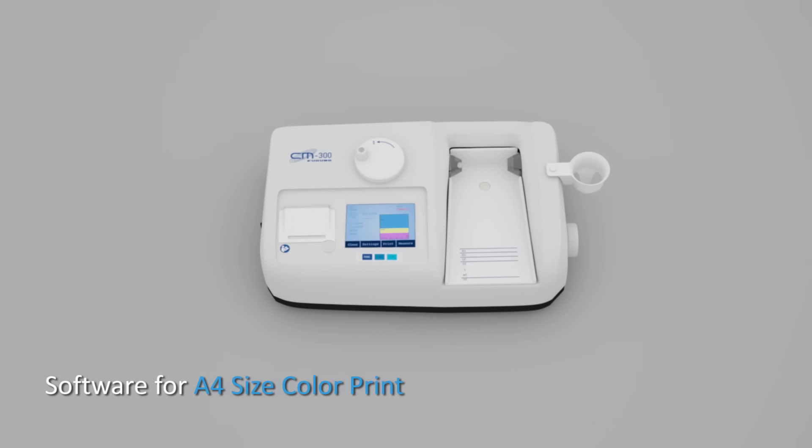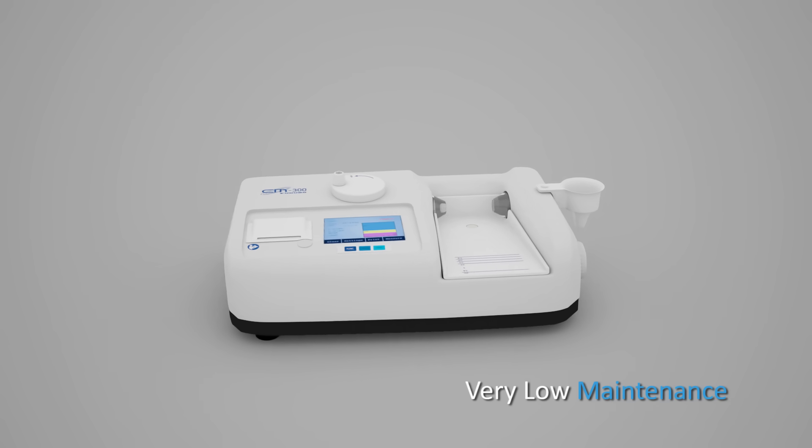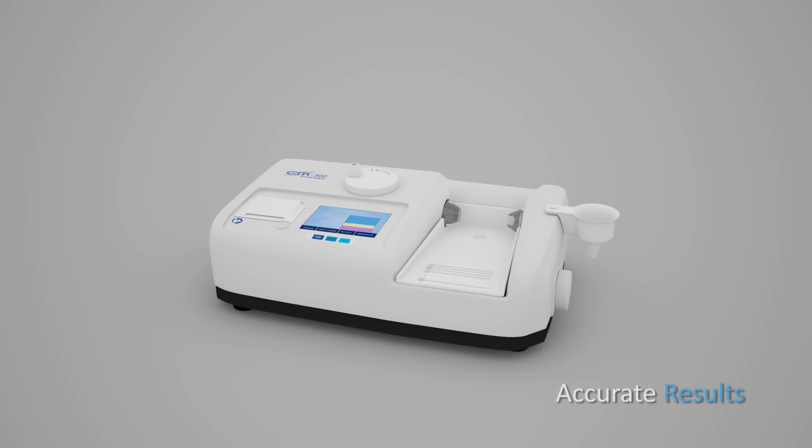Additional features include software for A4 size color print, very low maintenance, and accurate results.